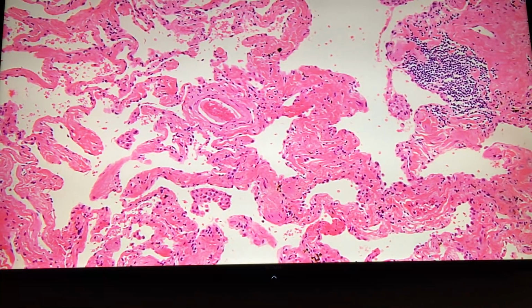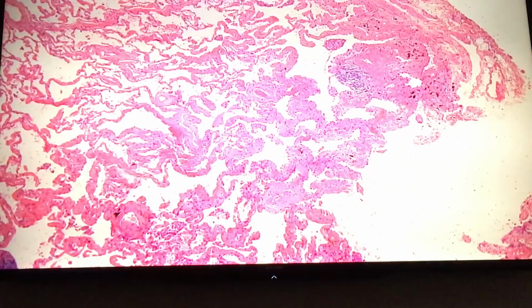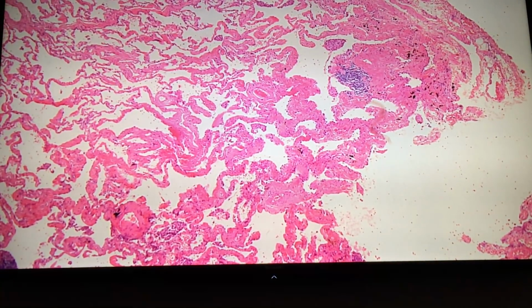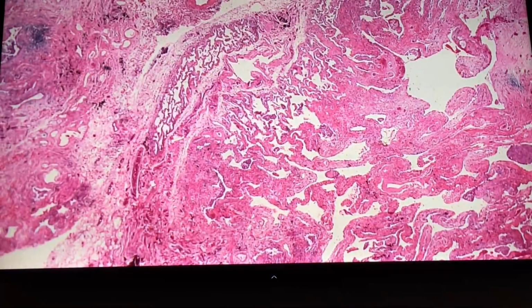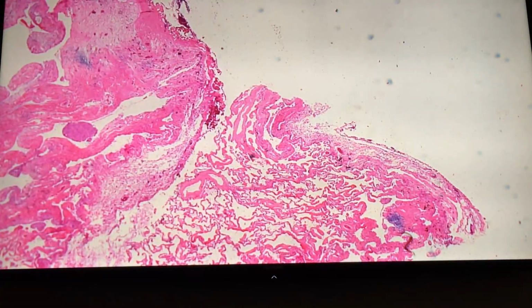There must be RB in the background. If there's not RB, it's not SRIF. You're probably misinterpreting something else. So it has to have the ropey collagen, the RB, and there's a third thing that always is there with this. Emphysema. Who said that? May, good. So just go low mag, and now try to find an emphysematous area where you can see that the air spaces are big. Like even those. See, there's a big hole there on top left.